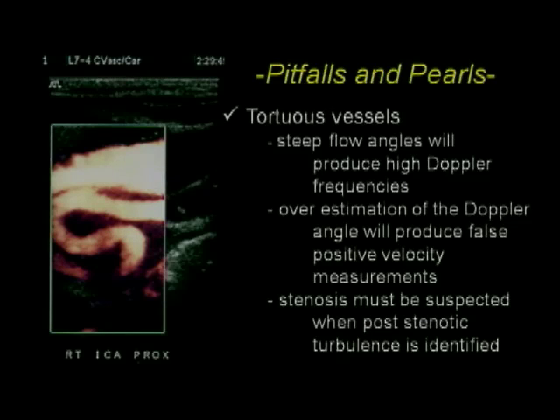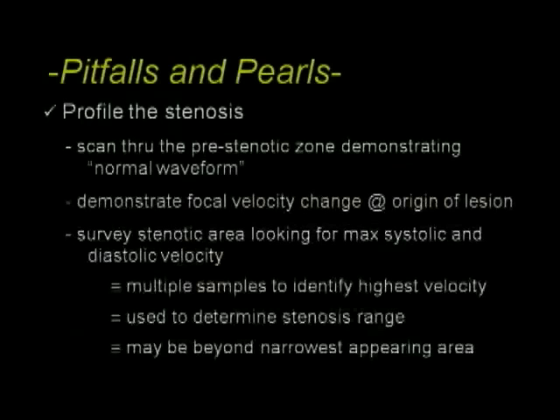However, keep in mind that it is very unlikely that you will encounter an atherosclerotic lesion. It just doesn't happen out in the distal internal carotid artery. You can have stenosis from other pathologies, dissections, and things of that nature, fibromuscular dysplasia. And again, the carotid artery criteria would not be applied to the distal internal carotid artery.